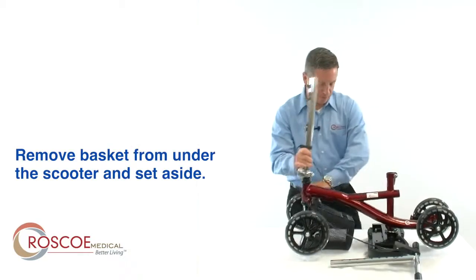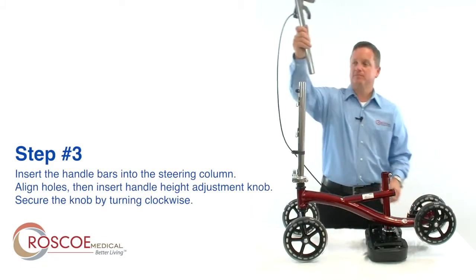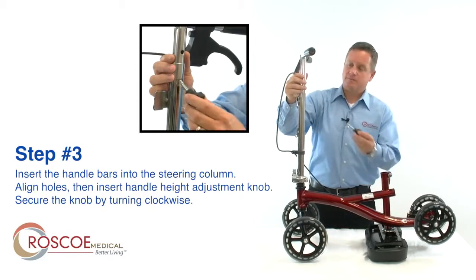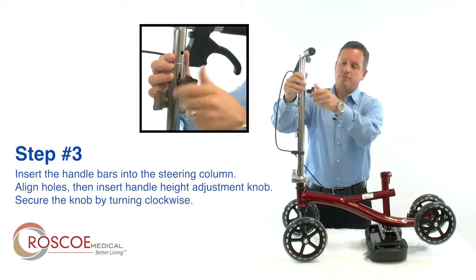Be sure to remove the basket and set aside. Step 3: insert the handlebars into the steering column. Make sure the holes are properly aligned. Insert the handle height adjustment knob and secure it by turning clockwise.